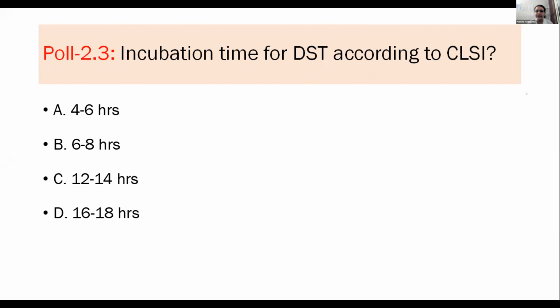Correct. Very good. And in EUCAST, can somebody tell me what would be the incubation time for the DST? 4, 6, and 8 hours. Yeah, 4, 6, and 8 hours. And how much amount of blood should be taken there? Okay, that I'll be explaining to you.